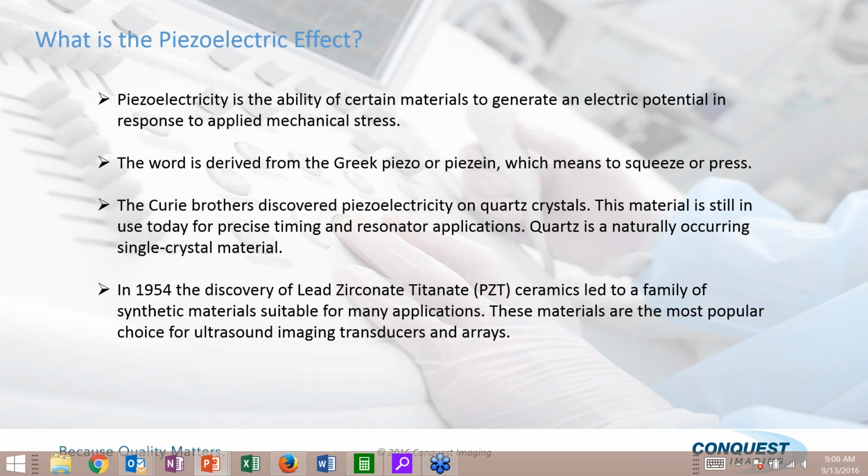The vast majority of ultrasound transducers utilize a ceramic type material. Some use silicon, but there are some man-made materials that are being developed now by the manufacturers, a single crystal transducer array. So there are various materials that are utilized, but essentially they are a crystal in nature.